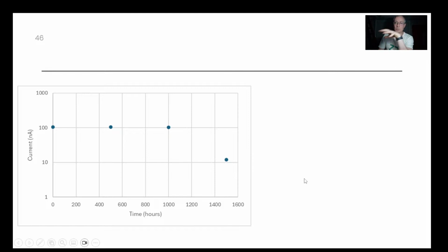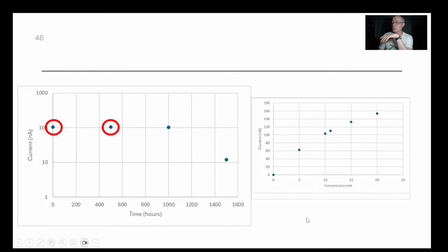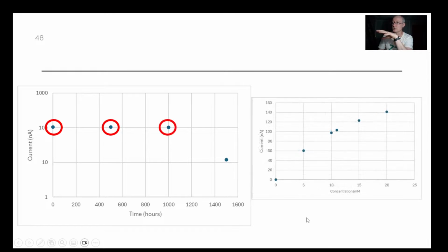I'm just saying, when you know the background bioelectrochemistry behind these things, you can actually figure out what their current versus concentration probably look like on that particular sensor. In this particular case, the sensor was quite stable, and so these are all me using the Michaelis-Menten to figure out what I think their sensor probably looked like.